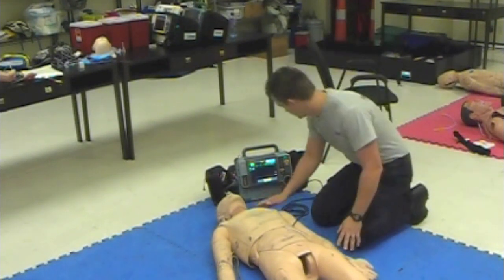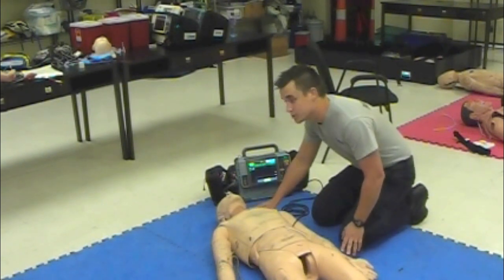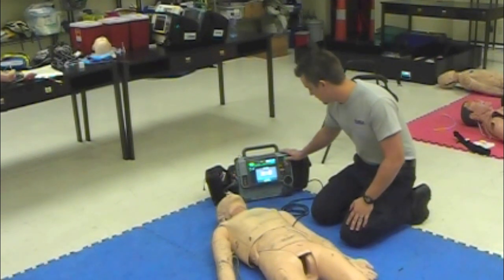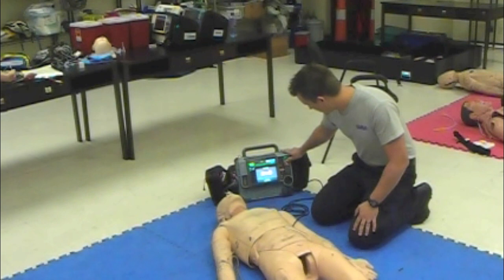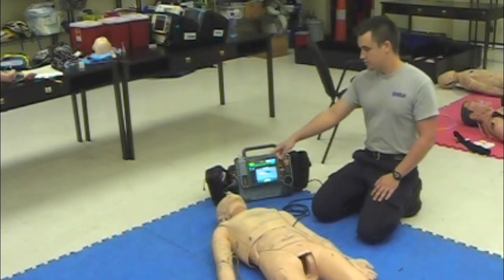Okay, I see VTAC on the monitor. Do I have a pulse with this? You do. I have a pulse with this. All right, I'm going to synchronize cardiovert, and since I haven't shocked yet, I'm going to start at a 100. Okay, so it's synced. I'm going to charge it up while they're still doing ventilations.